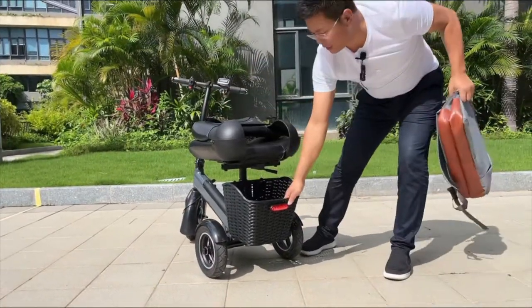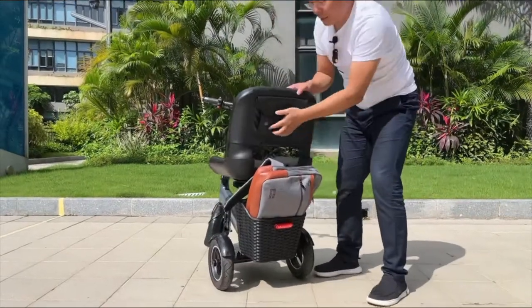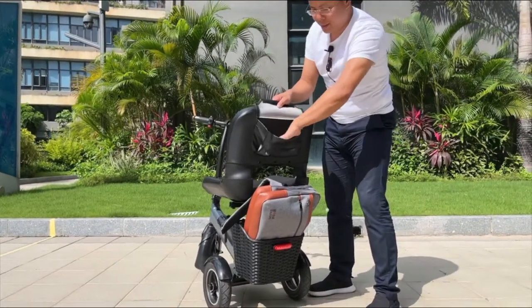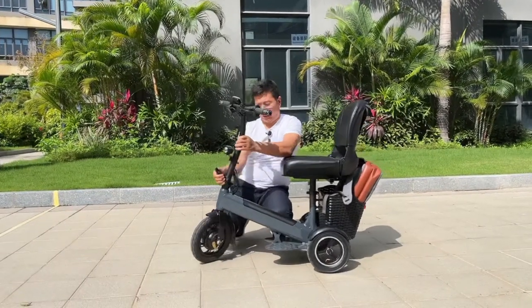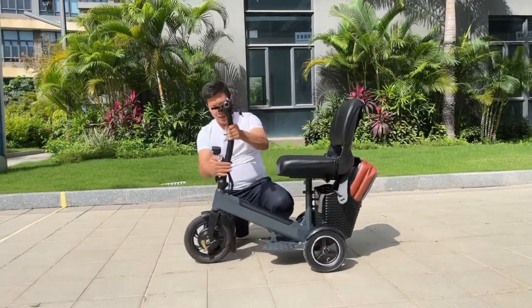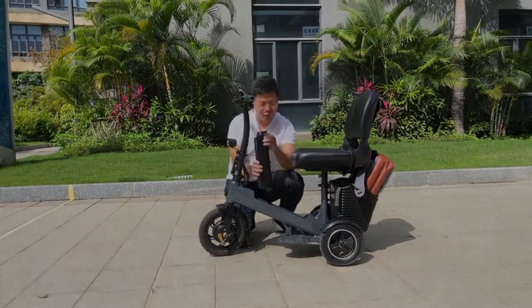It has a storage box like this, and also a small bag here. Very convenient. It can fold from here, and also the battery is removable from here.